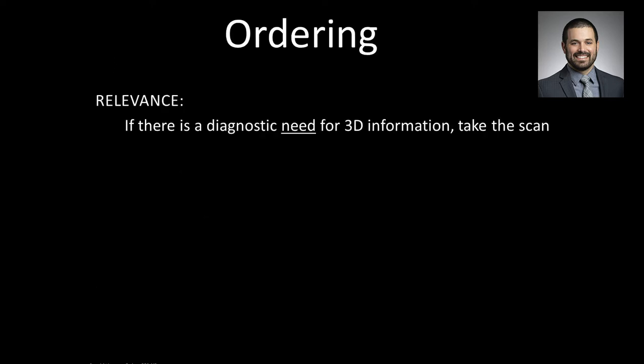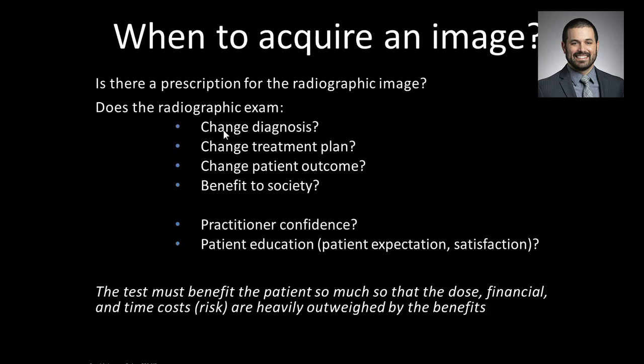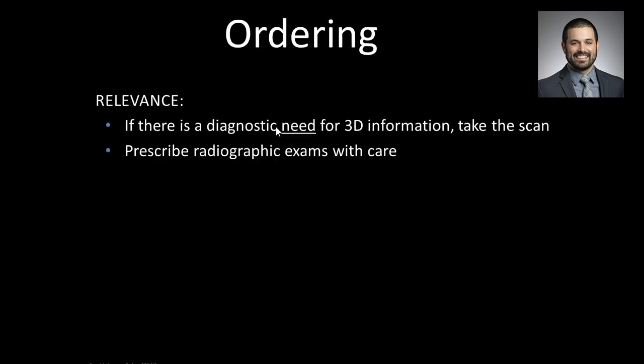So we also talked about these points here, and if there is a diagnostic need for that 3D information, go ahead and order that scan, get it. And I use diagnostic here generally. So back to my prior scan, it may change your diagnosis, but if it helps you diagnostically influence or alter your treatment plan, it's worthwhile getting.